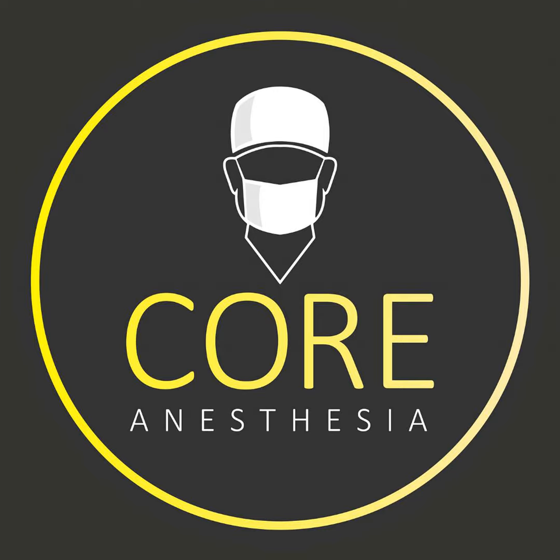lower point than normal. And then when you start to inspire, you have positive pressure, and it forces the rest of that CO2 that was kind of sitting there through the sample line and causes that quick jump. It gives you your final end tidal, and then it drops down. So that's a really telltale sign of a sample line leak. And just switch out that line and see if that corrects it. Again, a really good monitor to tell us a lot of what's going on with the patient.